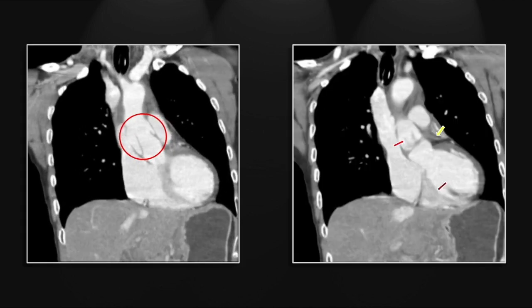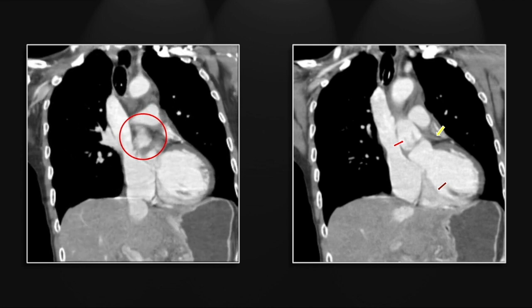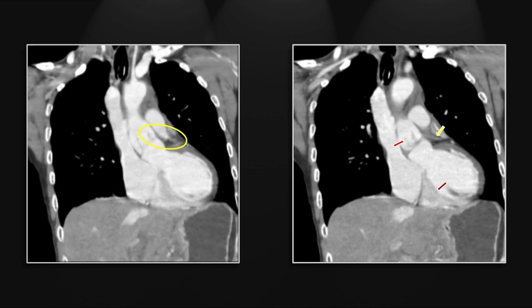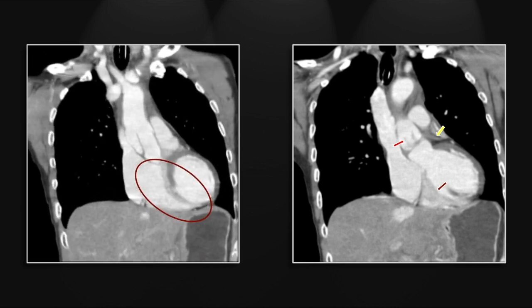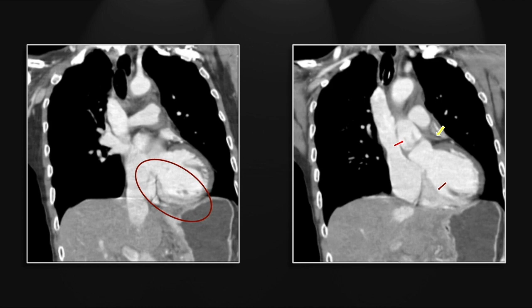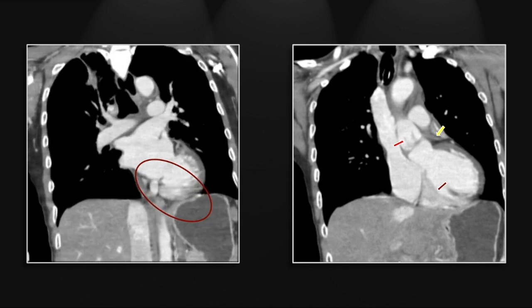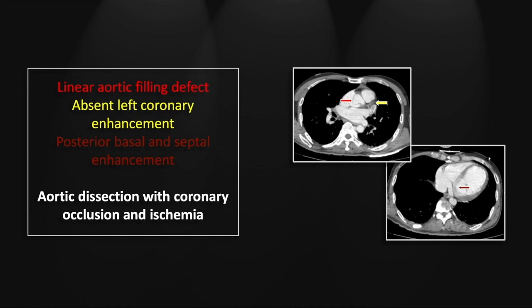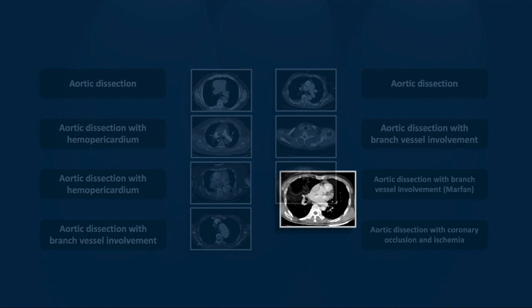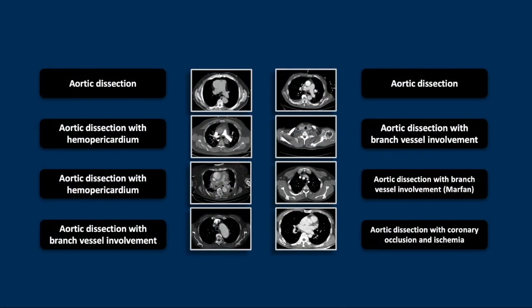On the coronals again the linear filling defect and the unopacified left main coronary are visible. There is that bit of myocardium that is receiving normal perfusion. So that is an aortic dissection with coronary occlusion and resultant myocardial ischemia. And that concludes this session on aortic dissection.